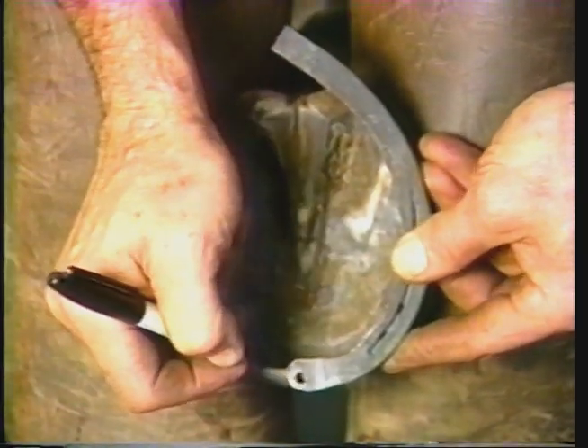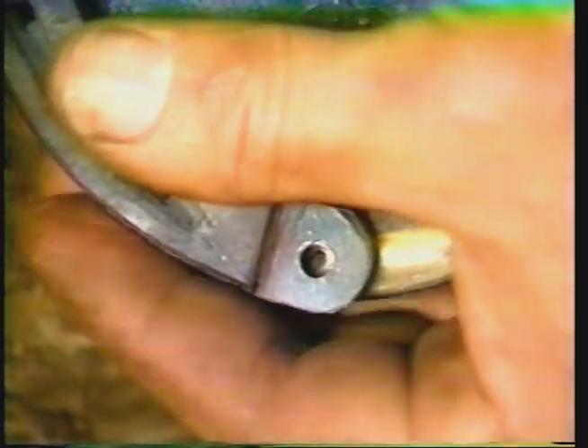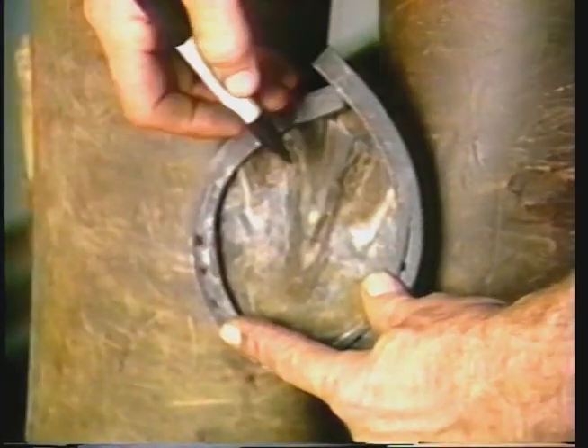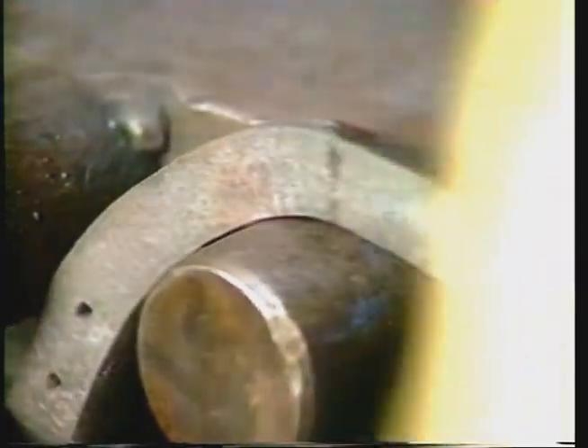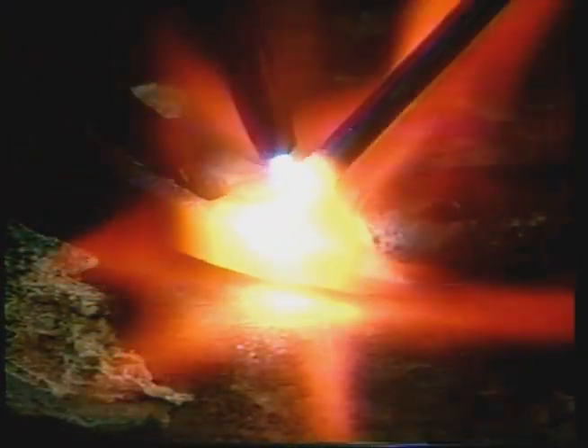Once you have made your hinge, place it on the foot and make a mark at the toe so you always place it in the same spot, then shape each half to fit that foot. By doing this you do not overuse the hinge while shaping the shoe. Make a mark on the heels and turn them — I turn mine on my cams, large cams off the side of my anvil, which works very nicely. You can turn this cold. Put your mark on the edge of the cam and turn almost a 90-degree angle. Then I prefer to put borium on the front edge of the hinge to protect against wear. Remember you have taken half the stock off the front of the shoe to make the hinge, so it will wear very quickly.